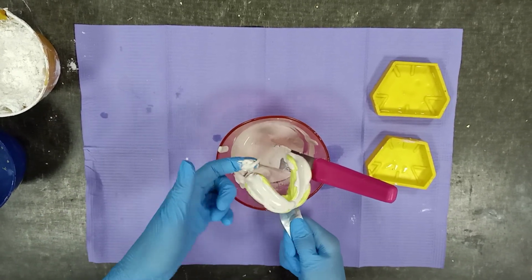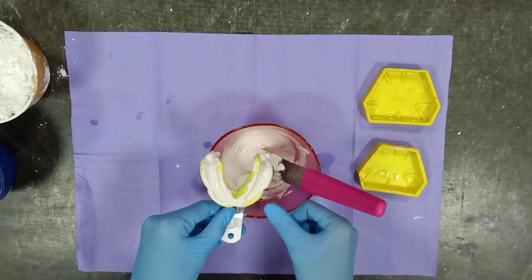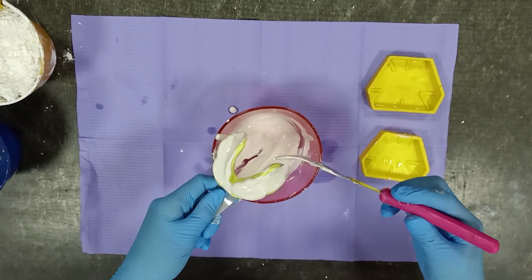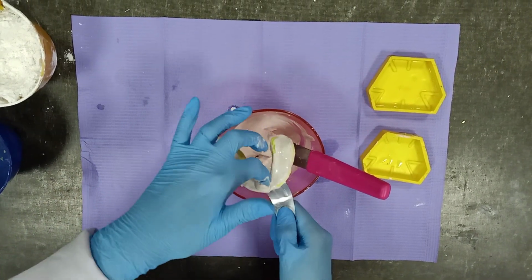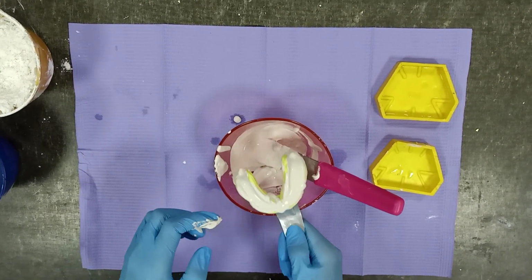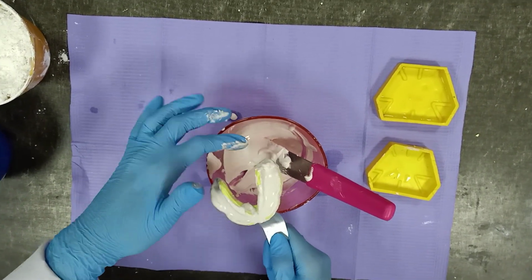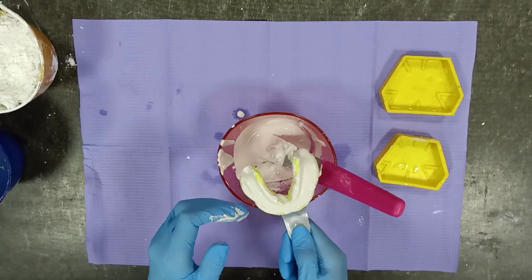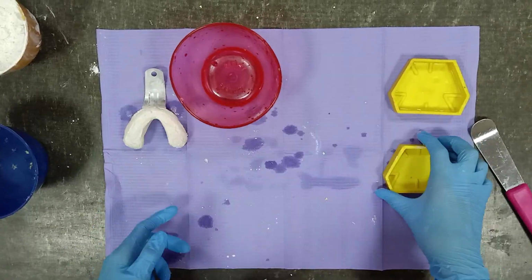Keep pouring in layers and tapping the impression against the walls of the rubber bowl. Remove any excess. And now leave it to dry.